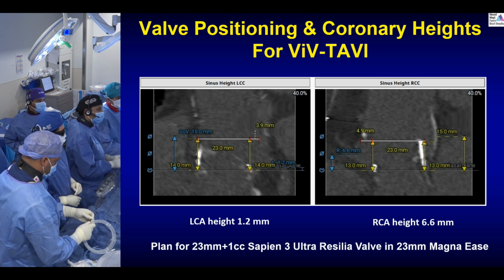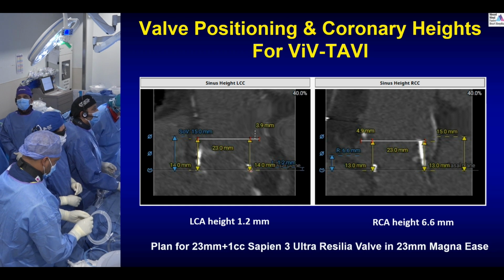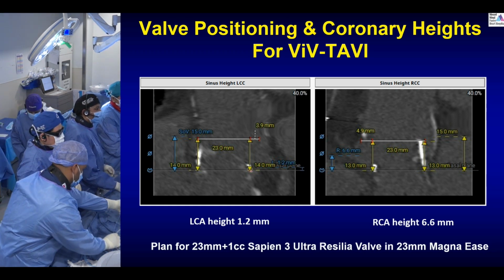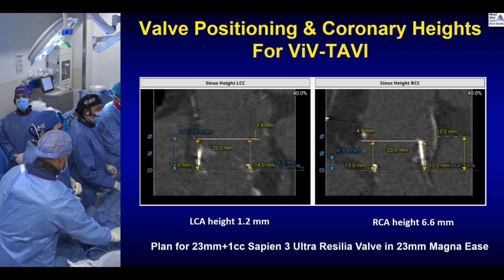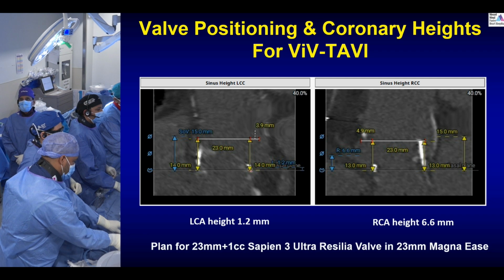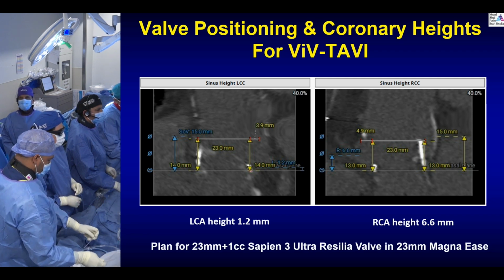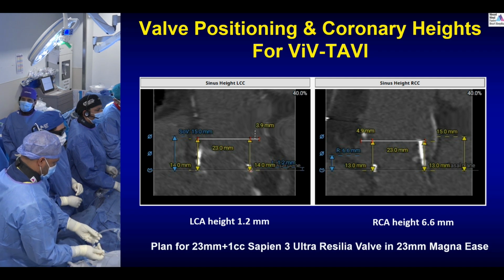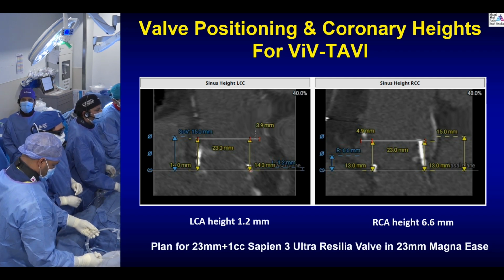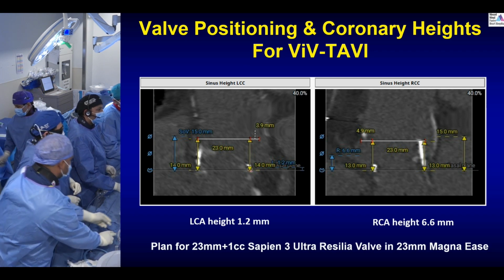The concern with a supraannular self-expanding valve, a tall valve in general, is that it's going to be very hard to get back to that coronary. If you have to go outside the frame, it's not that straightforward. So we think that even at the risk of putting in an intraannular balloon-expandable valve, you can definitely get a supraannular self-expander in the future when this valve degenerates. So we can potentially do 2 lifetime management interventions on this patient, not just one. That's the reason, Ashok, because of the very low coronary height.